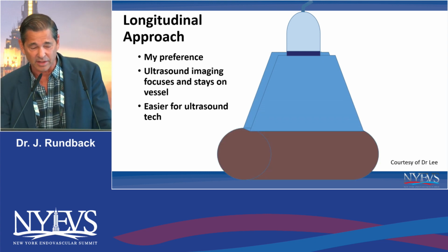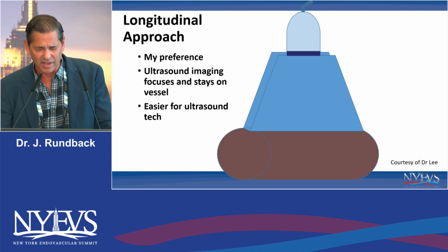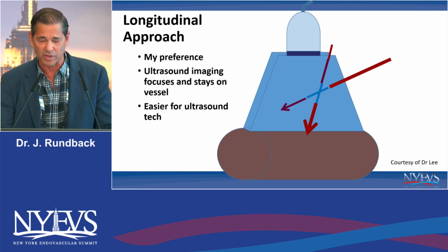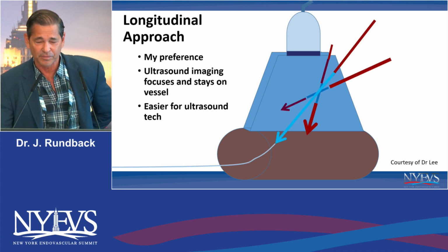And again, these are ultrasound techniques, but if you're comfortable with ultrasound and you're doing it yourself, you'll find that sometimes you go transverse, sometimes you go long, and often you do both, and you switch back and forth as you go.